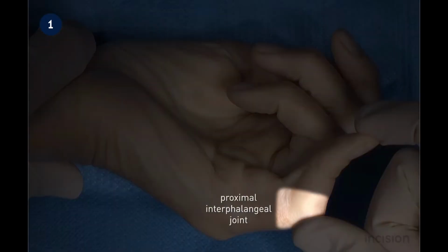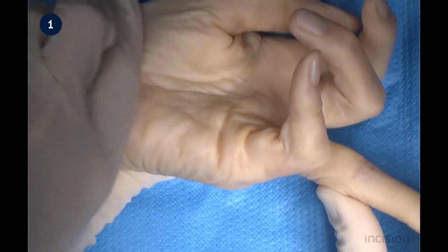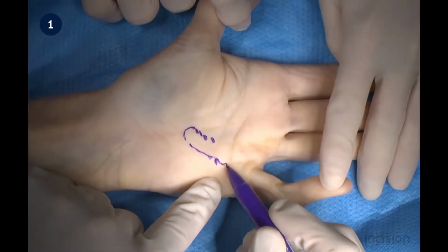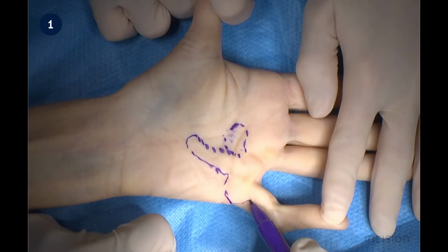Extension of the proximal interphalangeal joint is limited, which is demonstrated well from a lateral point of view. The fourth digit is also affected, but not as extensively as the fifth, as the extension of the joints is not limited. The pretendinous cords feel thicker and more rigid than healthy tissue. Palpation can therefore be used to identify these cords. The area of diseased tissue is marked on the skin.